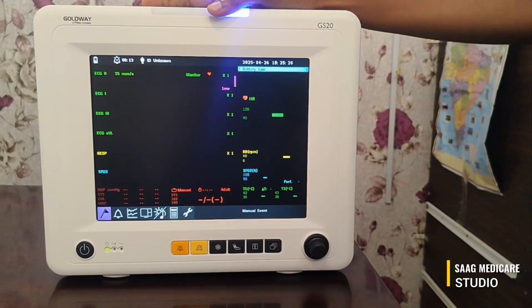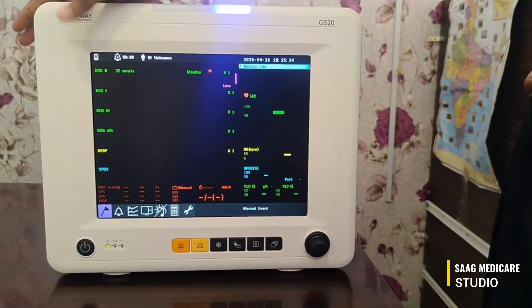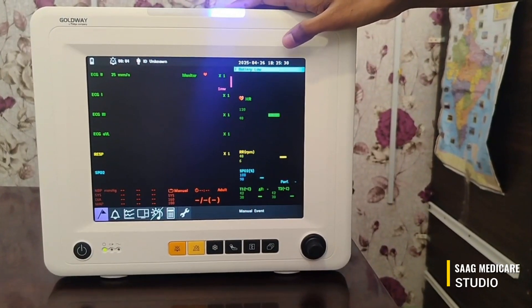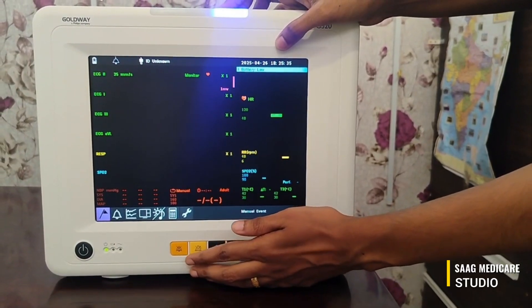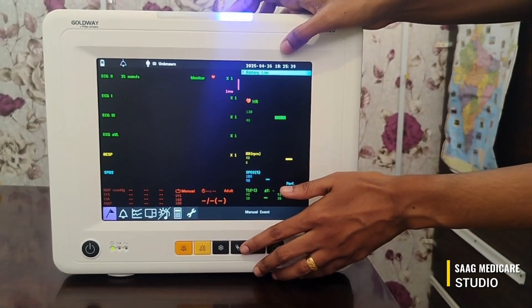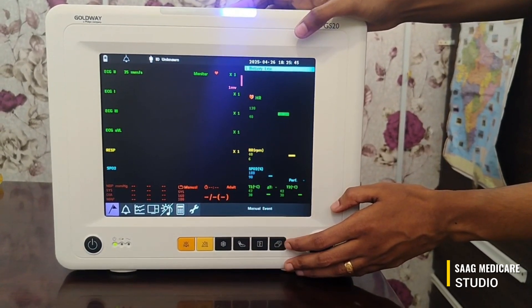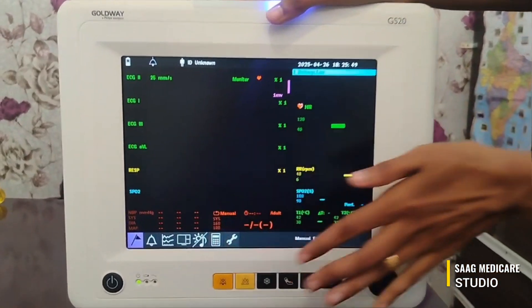This is the home page of the machine. Here we can see battery indication and the alarm indication. This is the patient ID field, and here is the date and time. This button is the alarm muting button, this is for freezing, this is for the NIBP function, and this is for recording values. This button is for the main menu, and here we can see the numerical values.